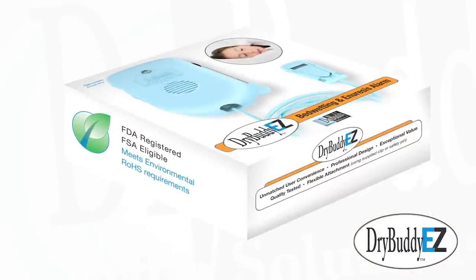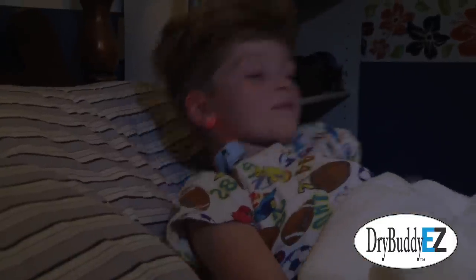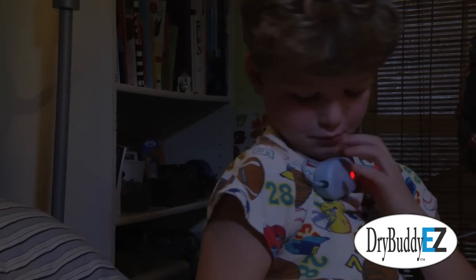The Dry Buddy Easy is an innovative alarm that senses when bed wetting occurs and wakes your child with sound, vibrations, or both.